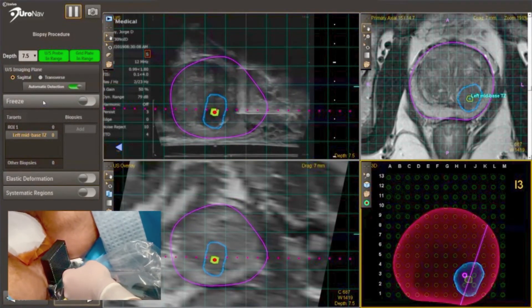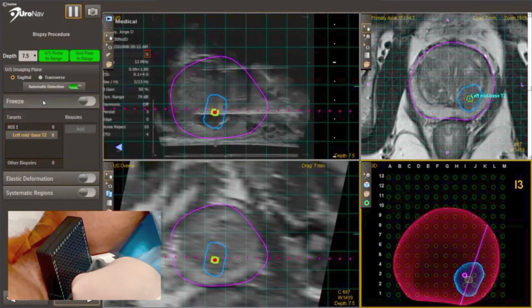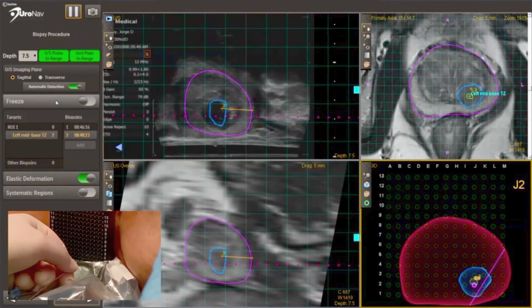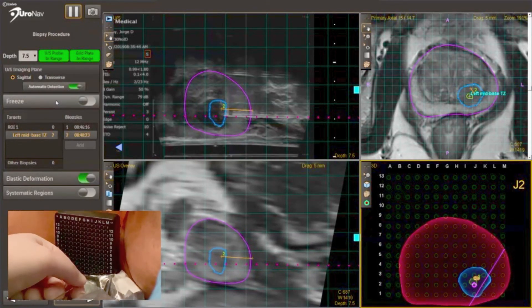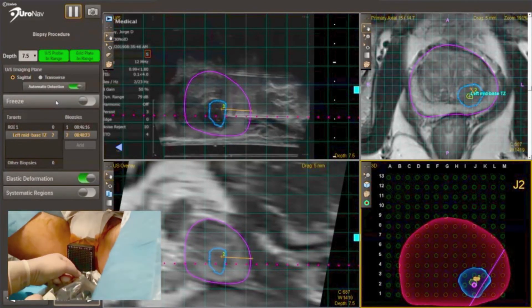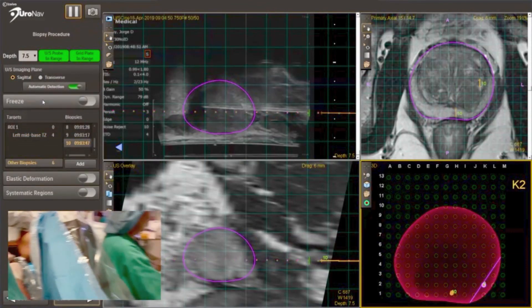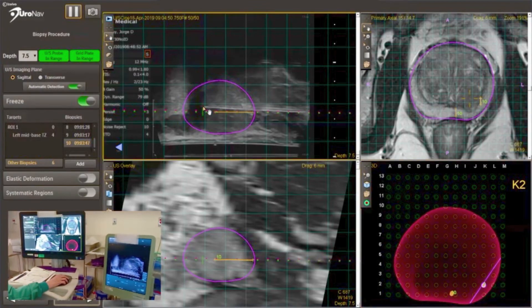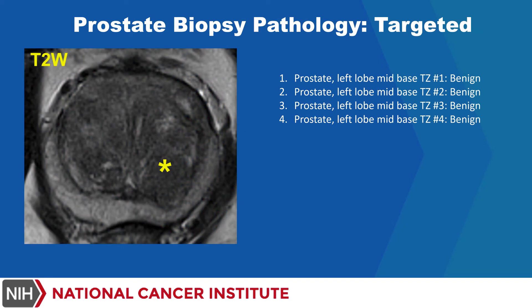The targeted lesion is then biopsied utilizing the URONAV platform as a real-time guide. Several cores are taken from the targeted region to ensure that the lesion is accurately characterized. Following biopsy of the targeted region, the prostate is then systematically biopsied using the 12-core template. Pathological review results showed benign tissue in all 12 systematic cores, as well as all 4 targeted cores.